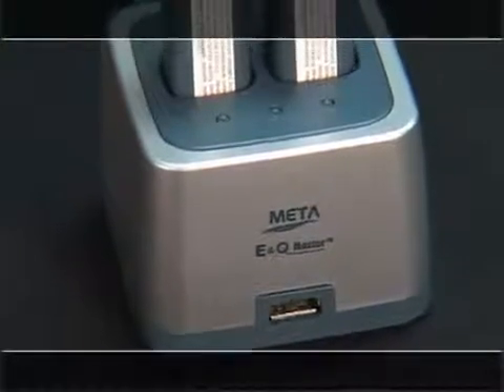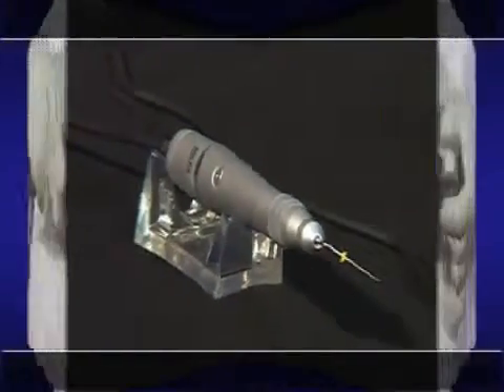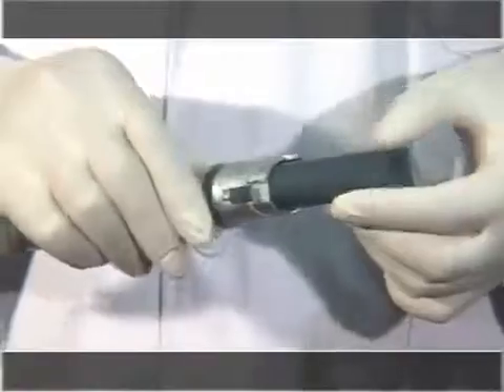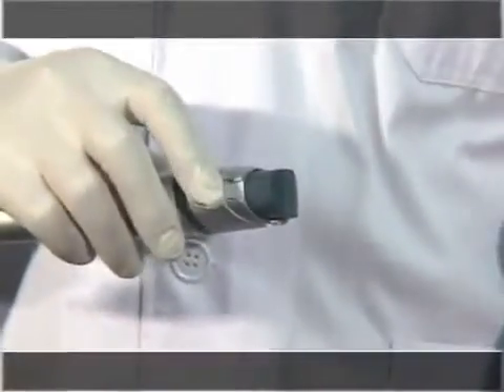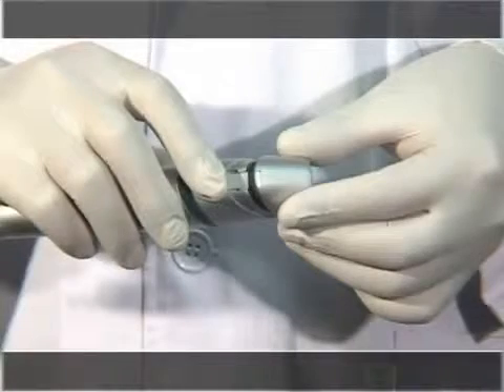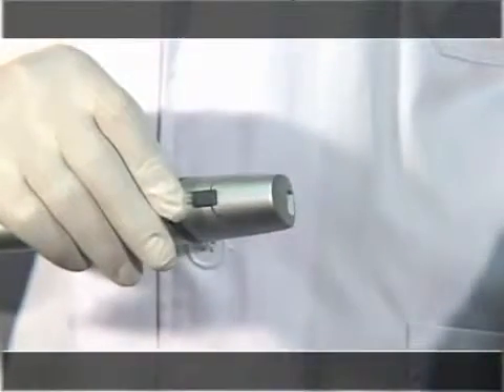The battery can be used for both the Master Pen and Gun, and it can be charged while contained in the instrument. First, open the battery cover as shown on screen. Replace the used battery with a new one. After placing the battery inside, cover and align the arrow-marked contacts together, then pull the battery cover switch down to use.